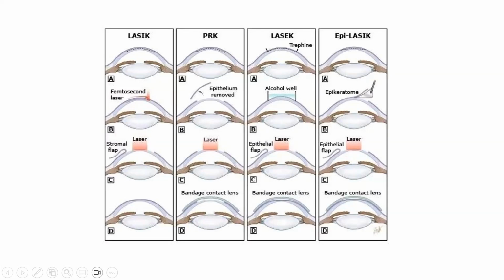In epi-LASIK, also known as epipolis LASIK, an epikeratome is used to make an epithelial flap, after which the excimer laser is applied, the flap is repositioned, and a bandage contact lens is put.